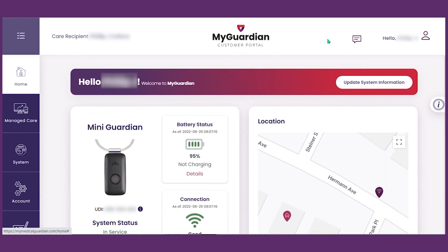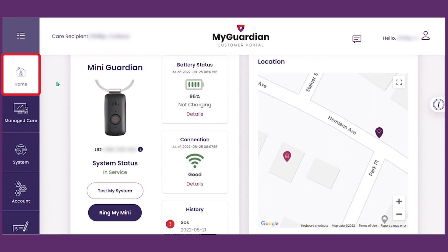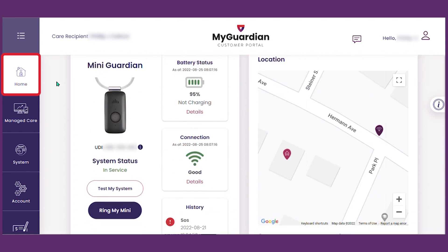Let's go back to the left side and briefly review the navigation menu. This is home — click this to return to this page. This page shows battery, signal strength, and location.